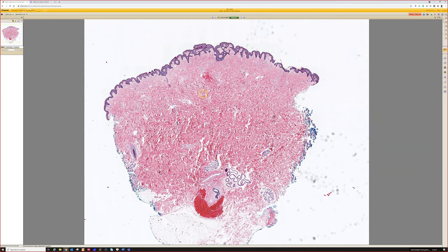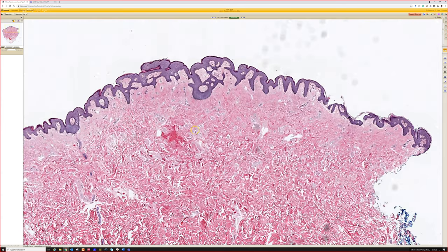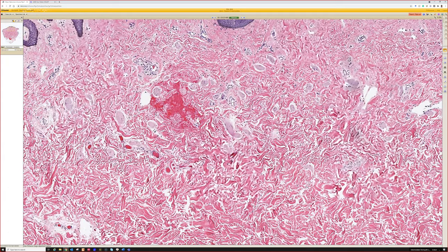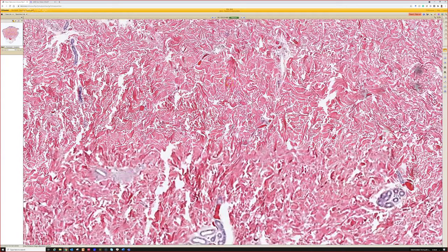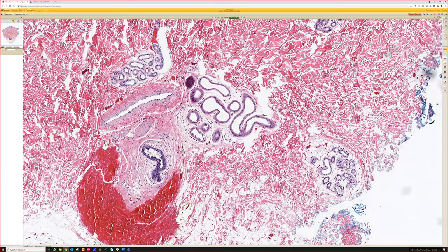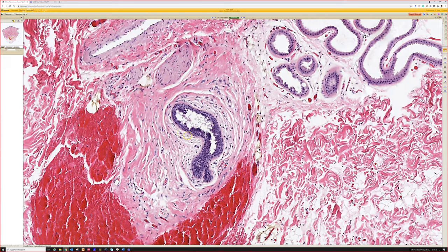22. Accessory nipple, yes. And it looks kind of like SEB on the top, papillomatous acanthotic epidermis, and smooth muscle bundles, more than there should be in the normal dermis. And if you're really lucky, you'll find down here a nipple duct. And look, also apocrine glands, because you tend to have apocrine glands around the nipple, so you can have them in accessory nipple too. And again, see, it's kind of a more columnar lining and more shaggy on the surface.